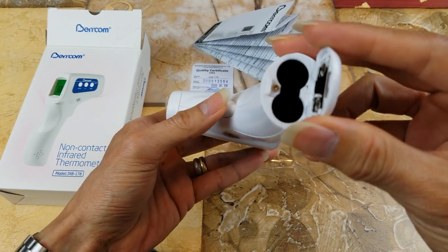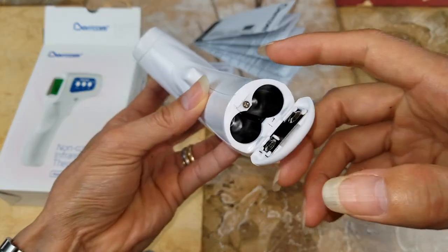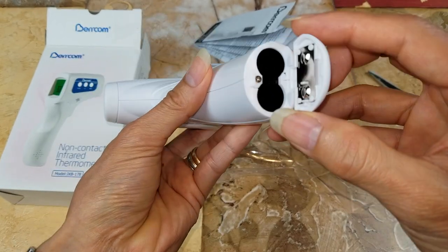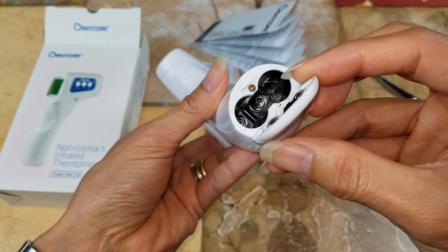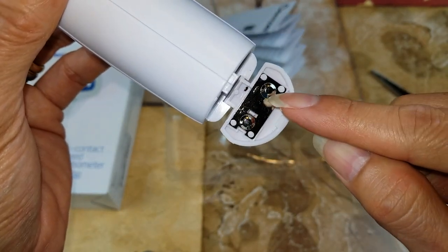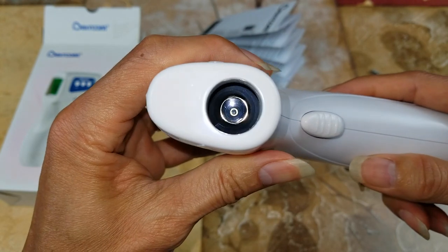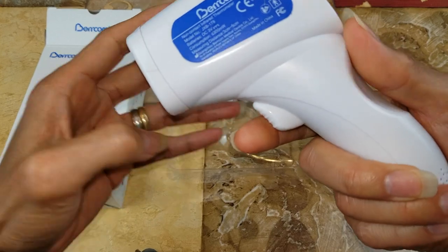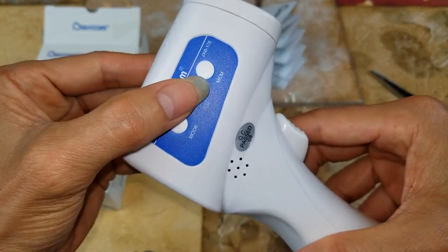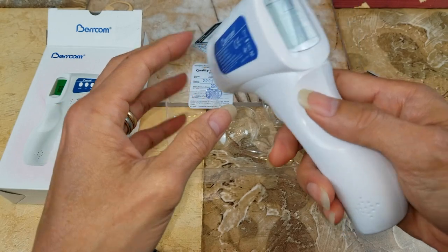It doesn't have the battery included — it requires two AA batteries. Let me turn the light on real quick. I'm not sure which is positive and which is negative — oh, there's a positive symbol right there and then negative. There's the lens or the reader, and here's the trigger, mode button, speaker on/off, and memory button. There's no dedicated on/off button.